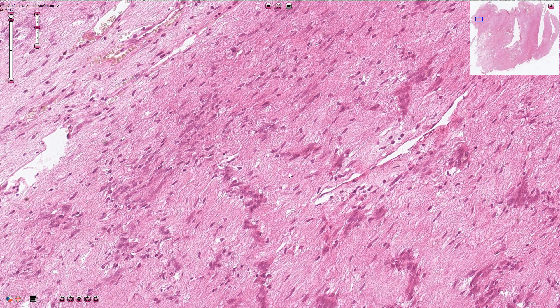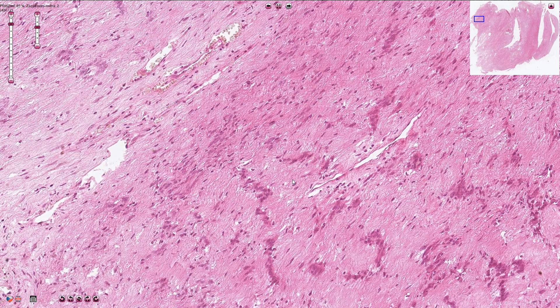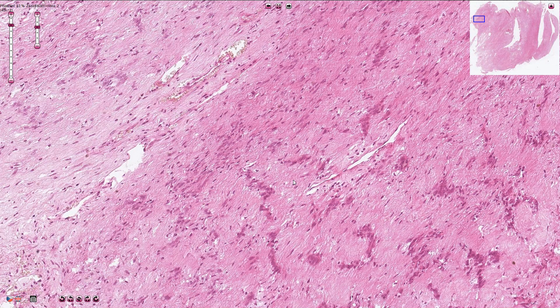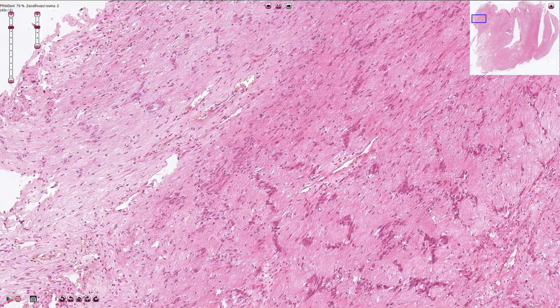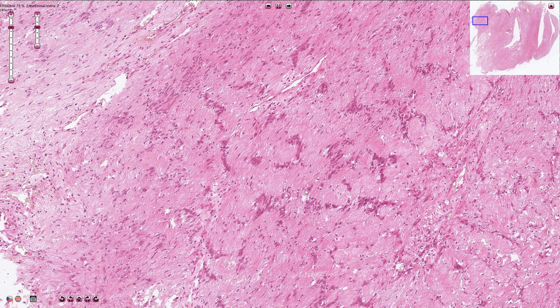On immunohistochemistry we usually see strong S100 positivity in these tumors, and mitotic activity is quite low. Important differential diagnoses include neurofibroma and malignant peripheral nerve sheath tumor, which would be more atypical and mitotically active. Most schwannomas are sporadic tumors, but some can be associated with type 2 neurofibromatosis.